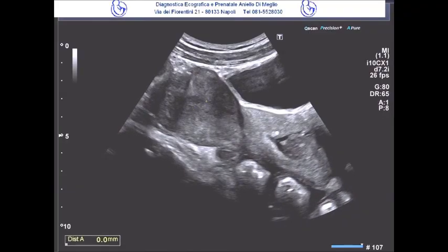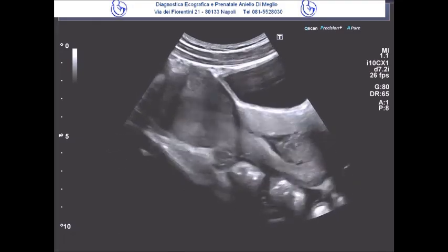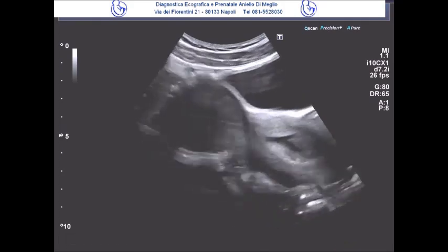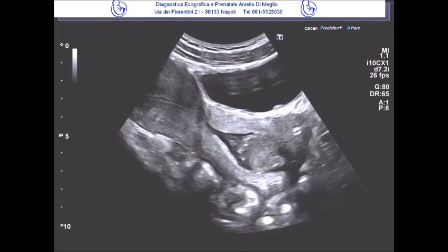We are now continuing the examination with a more detailed assessment focused specifically on the uterine structures. First, we are evaluating the endometrial thickness. The endometrium, which is the inner lining of the uterus, appears to be quite thin based on our measurements. This is a key observation that will be documented and considered as part of the overall clinical picture.